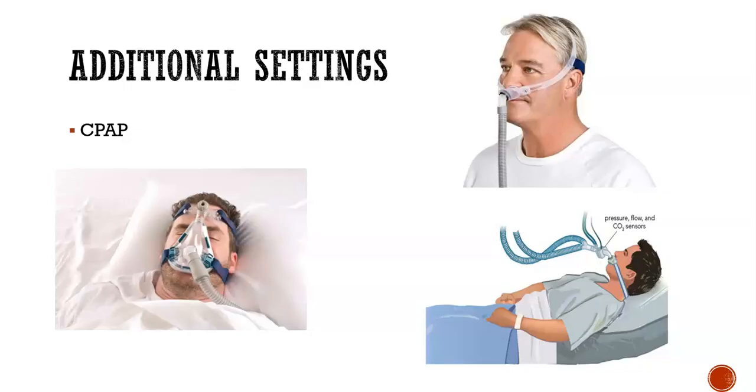This can be delivered, like I said, via either a mechanical ventilator or a separate device. And it can also be used or required during mobility activities. CPAPs can be disconnected for short periods of time during ambulation. And then CPAPs during physical therapy interventions may enhance a patient's tolerance, comfort, and compliance. If somebody's going to get out of breath really easily and a regular nasal cannula is just not cutting it, then we may be able to put them on a CPAP for a minute and try to get them through therapy if they really need it.